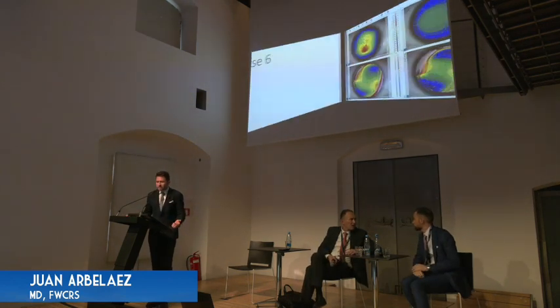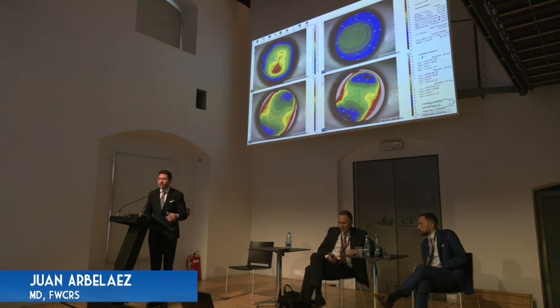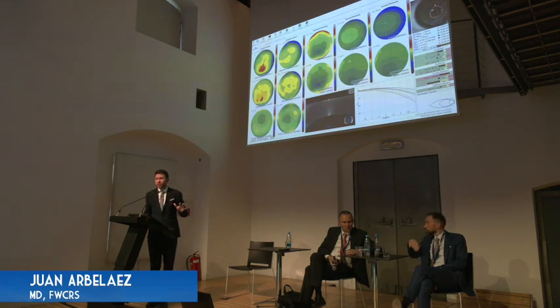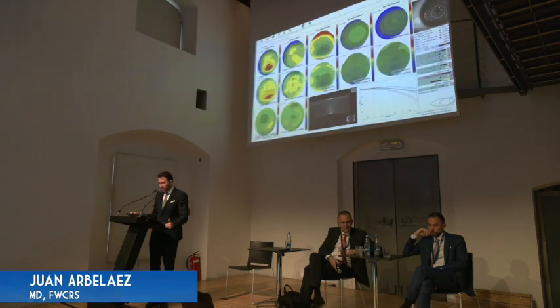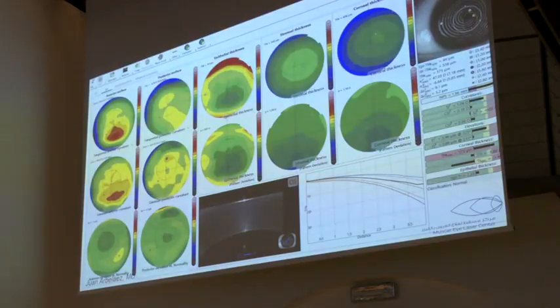Here is another case that shows us something similar, a patient with blepharitis, a patient that we wouldn't have done refractive surgery before, but it has an inferior epithelial hyperplasia due to the blepharitis in the right eye, as you can see, and in the left eye also the same inferior epithelial hyperplasia. The patient was treated for the blepharitis and had a SMILE lenticule extraction without any issues.